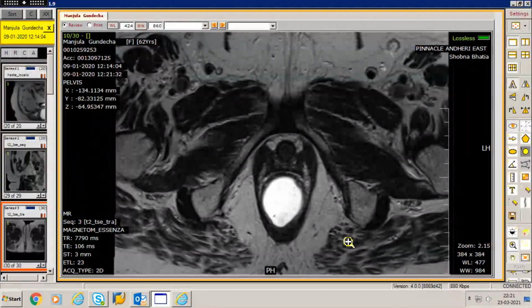Normally, you can get up to, or just short of, 1 centimeter descent of the pelvic structures below the PCL line. Anything more than a centimeter, especially for the anterior compartment, would then grade it towards a cystocele. Also look for vaginal prolapses. Usually mid-compartmental prolapses don't occur in isolation, but they're part of these conditions. And of course, the worst of the lot is rectoceles, along with rectal intussusceptions, and so on and so forth.